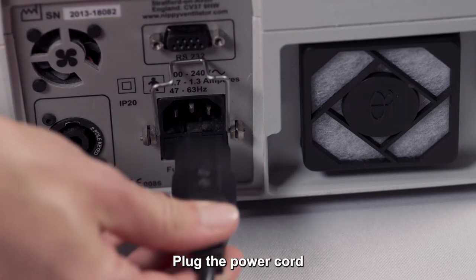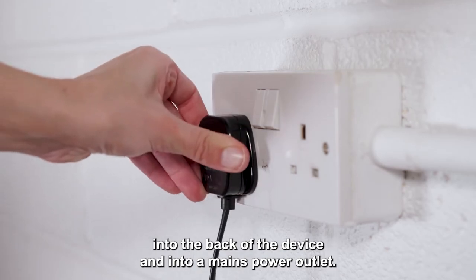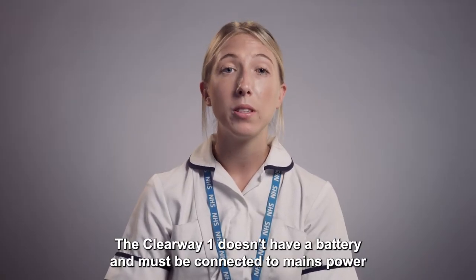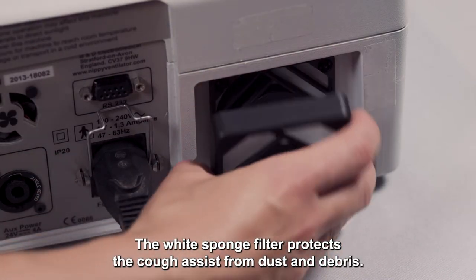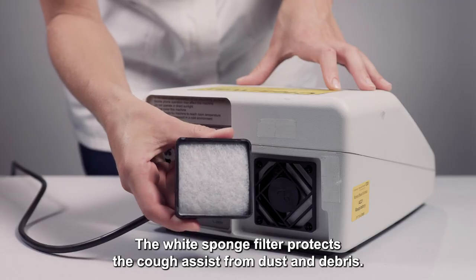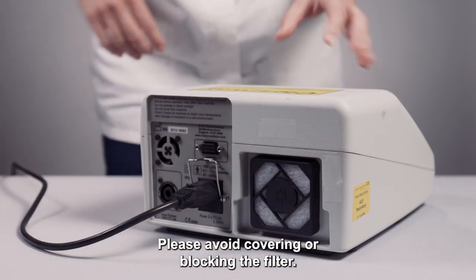Plug the power cord into the back of the device and into a mains power outlet. The Clearway One doesn't have a battery and must be connected to mains power to work. The white sponge filter protects the Cough Assist from dust and debris — please avoid covering or blocking the filter.